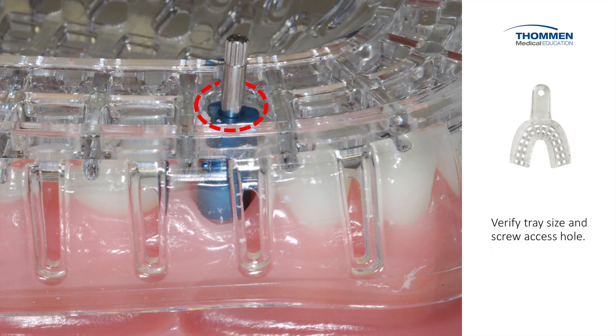We verify the tray size for the patient's dentition. We need to identify a hole that needs to be cut for access to the screw. We double check to make sure that there are no interferences and that the impression tray slides easily in and out and over the top of the screw head.